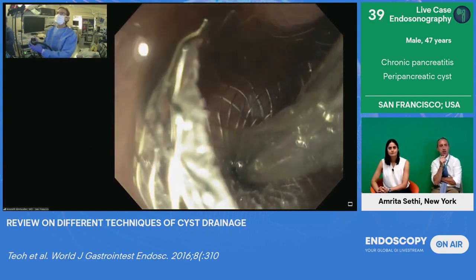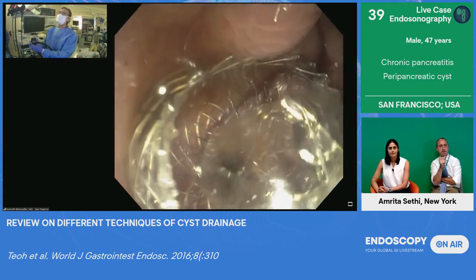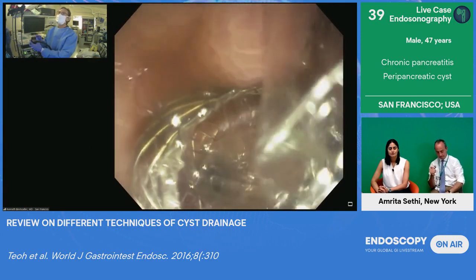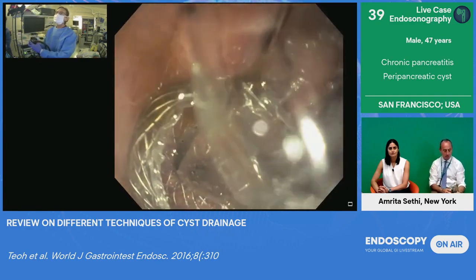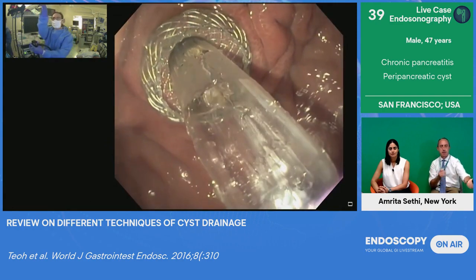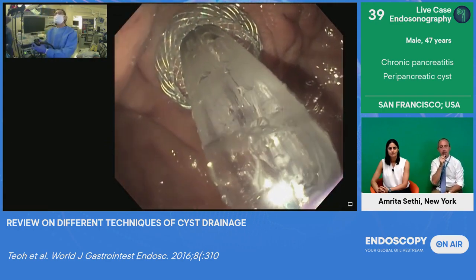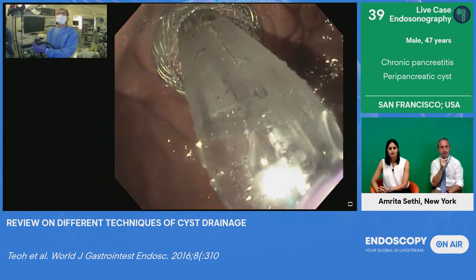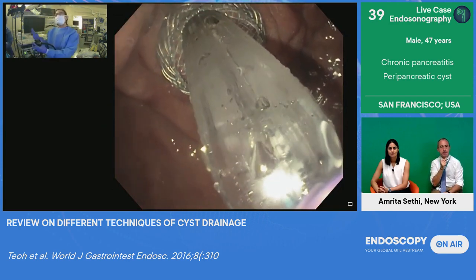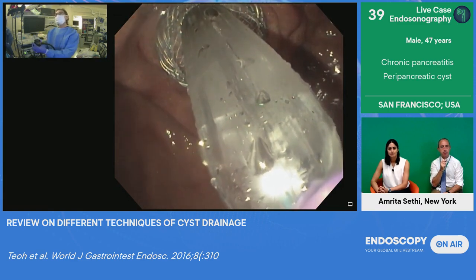Start to dilate up. We'll go up to 12 first, right? It's 12 to 15, so we'll go up in stages. And the nurse would just tell me, and now I can push it out like this. Make sure that it's in the axis, right? And you can see it inflating, right? And so I'm at 12. There's a little fight, so we just wait till that fight's gone. All right, now go up to the next level.